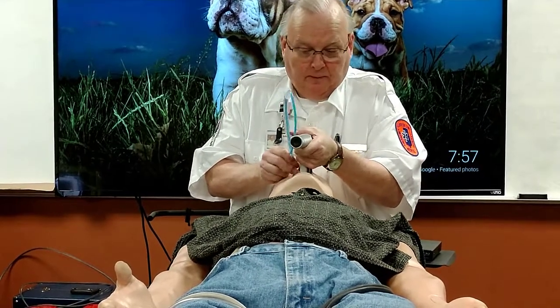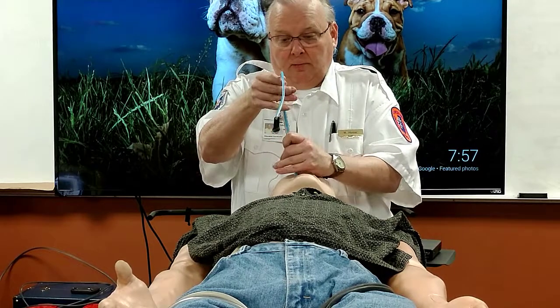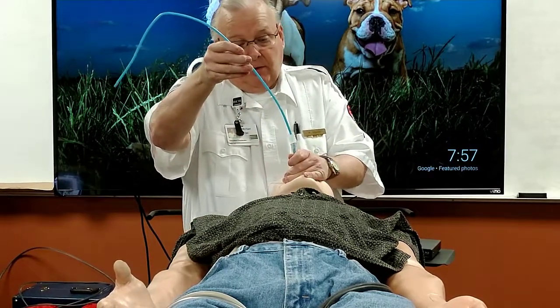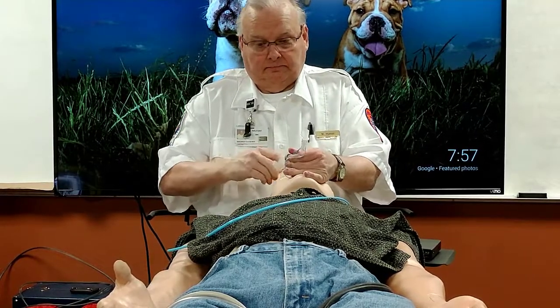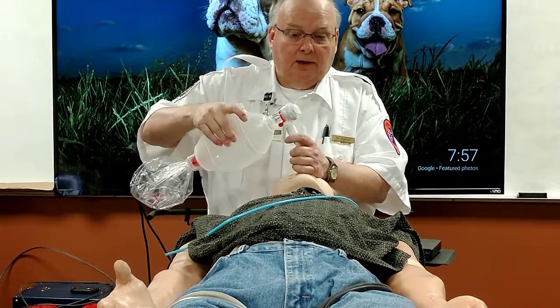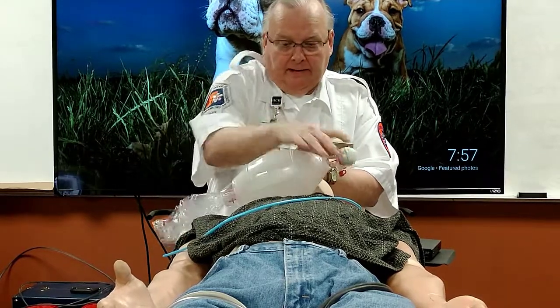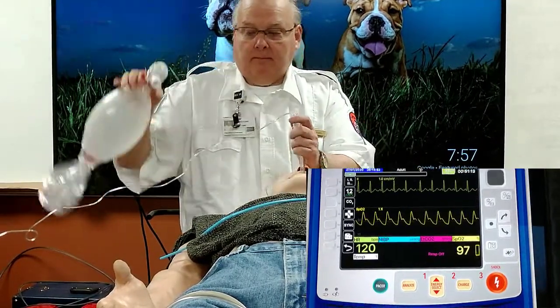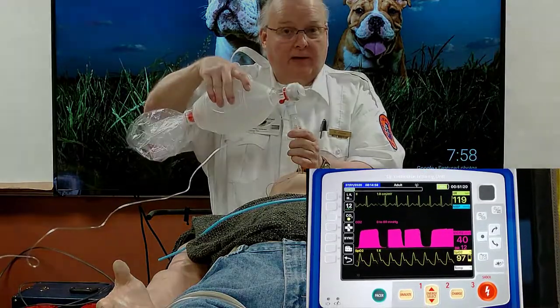Once that's done, we can let this go, and then we can advance our tube down over our bougie into the trachea. And then pull our bougie out. You want to make sure you hold on to your tube as you're doing this. Inflate your cuff. And then using your bag mask, check for lung sounds. Once that's done, we would put our end-tidal CO2 on, connect the bag, and continue on with our patient care.